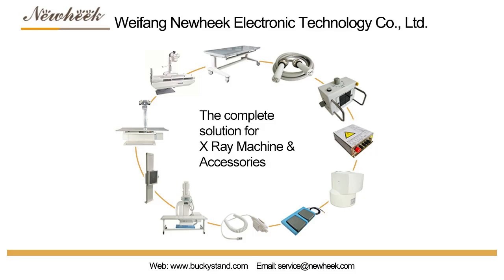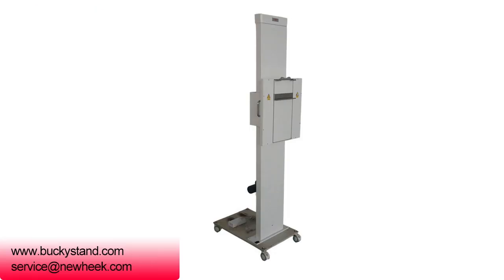Tell us about the fixed and manual Bucky stand today. Let's talk about the Bucky stand as a whole.